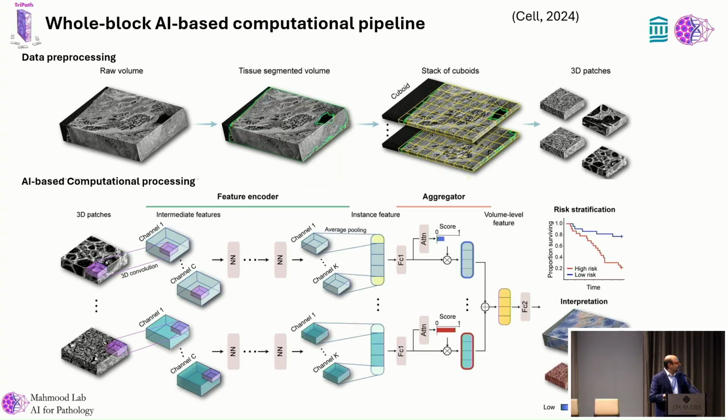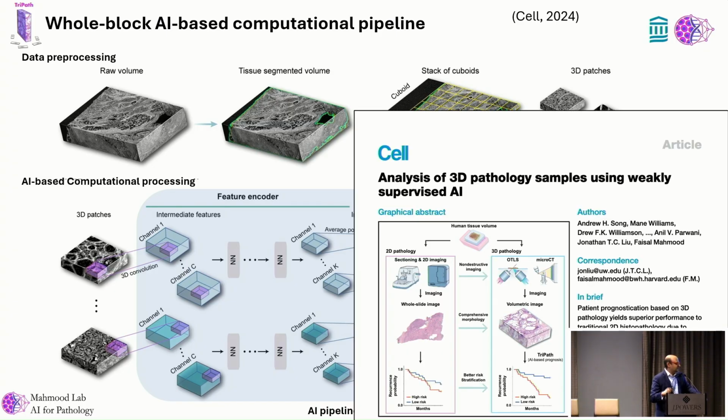So in this study from last year, we tried to see if we can scale this kind of multiple instance learning paradigm in 3 dimensions. It became obviously very, very computationally complex, but we managed to do it. And we also managed to make all of these tools publicly available. So it's very exciting to see how people have been using it for all kinds of other applications. So this study focused on prostate cancer, but people have used it on other non-cancer, pre-cancer applications as well.